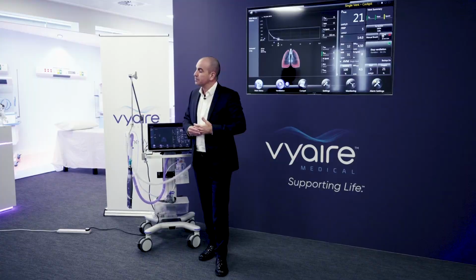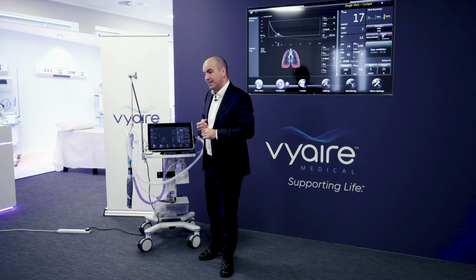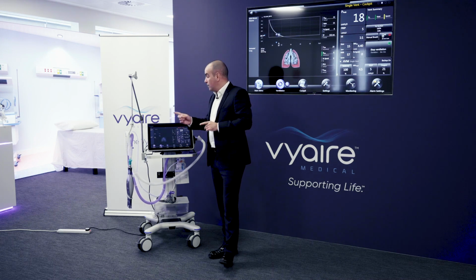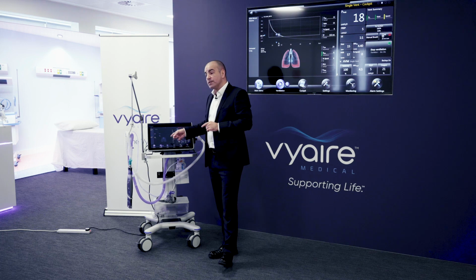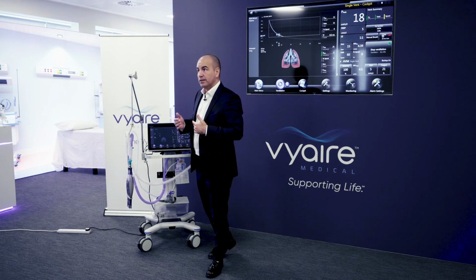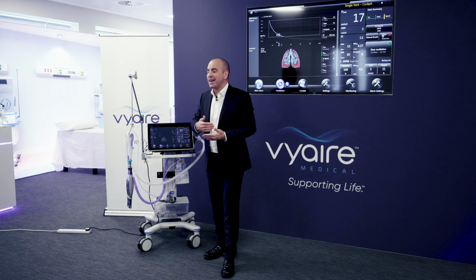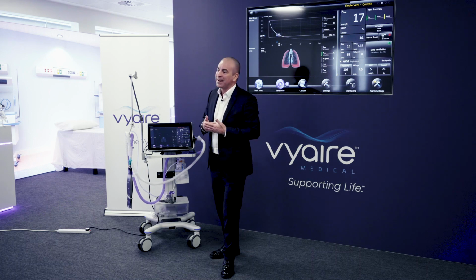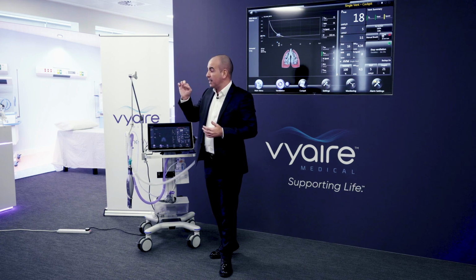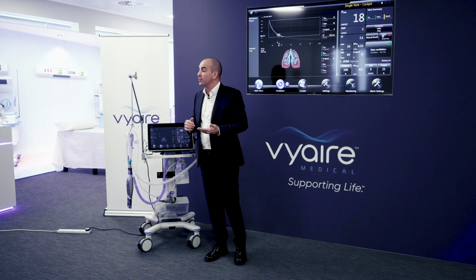Any questions? Does the Bellavista accommodate for people that have hiccups or coughing? So AVM, for instance, would be interrupted by the likes of... oh, sorry, okay, I see which track you're going down now. Right, so for instance, breathing through a tube, it's very narrow and it's uncomfortable. So we want to make it as easy as possible for the patient.